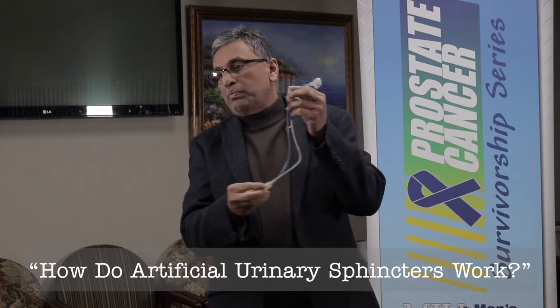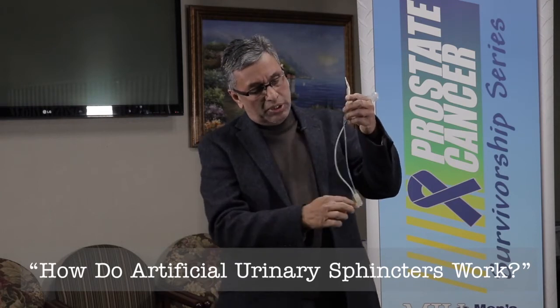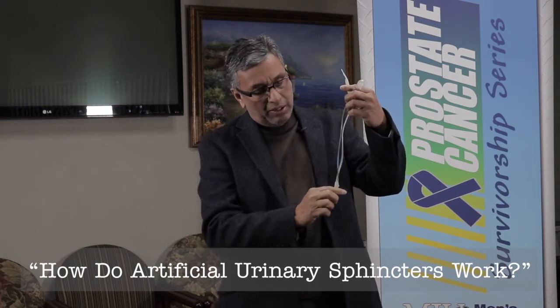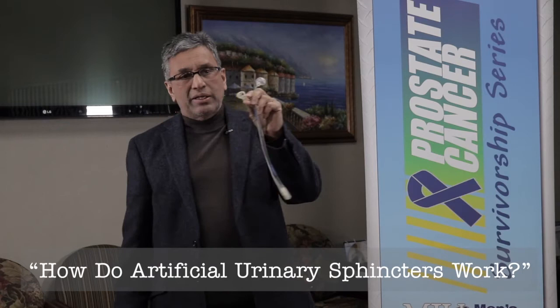When you are ready to pass urine, you press this pump. The fluid from here comes here, from here it goes back here, and from here it goes back and closes this cuff. It takes about 90 seconds.